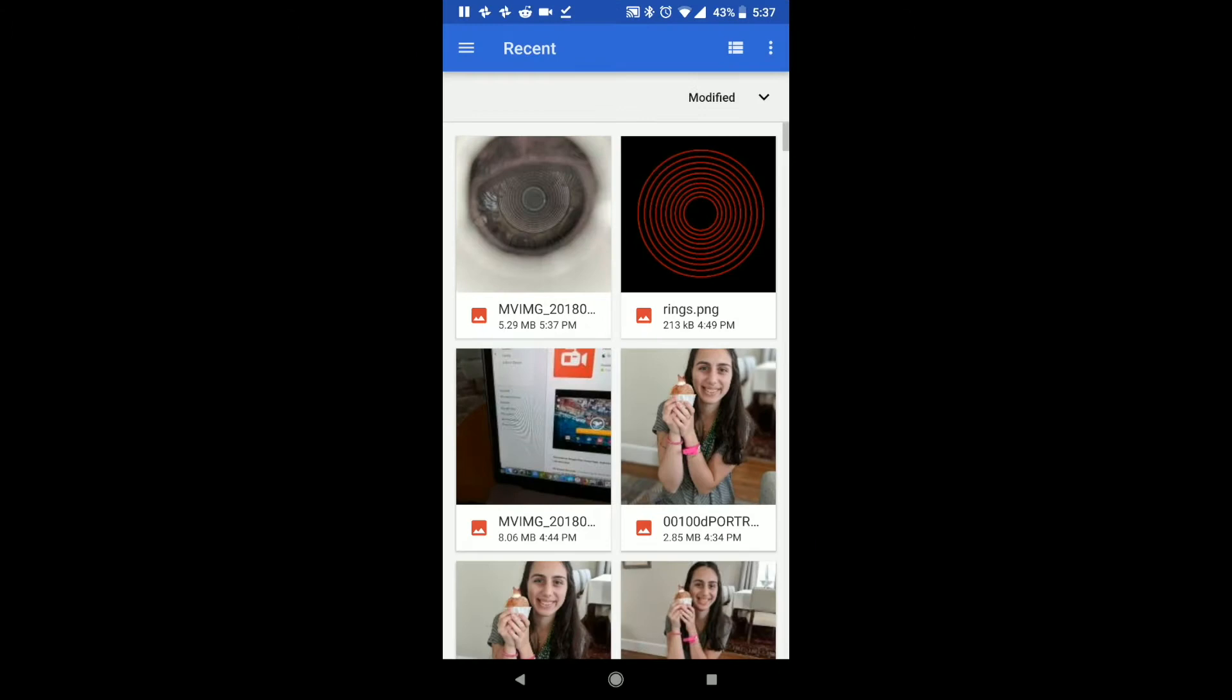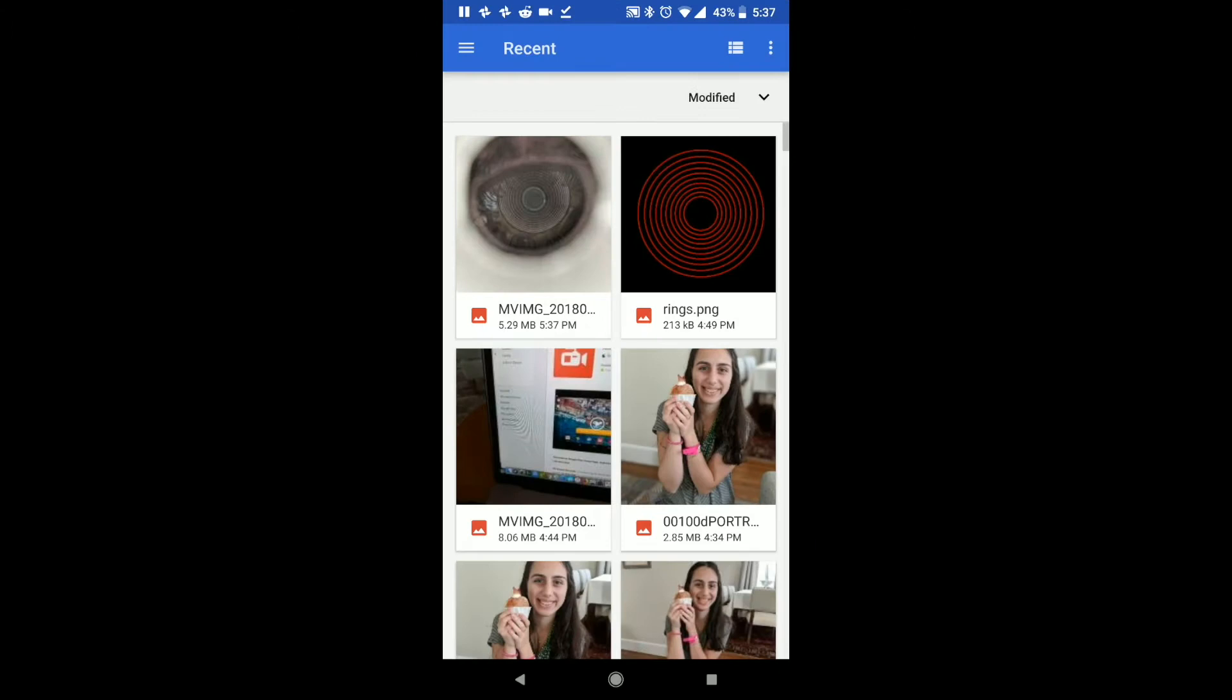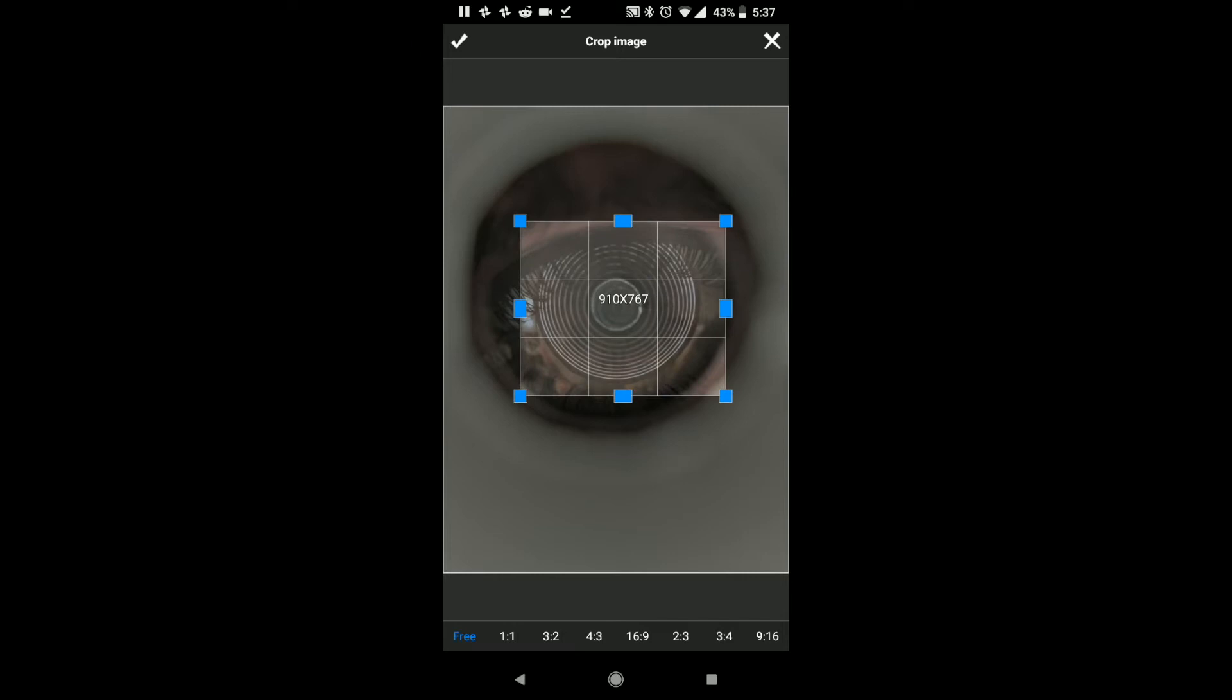I'm going to crop it because we don't need anything other than the rings. We're going to just crop it like that, and I'm going to say yes, crop image, and now we have our nice image here.